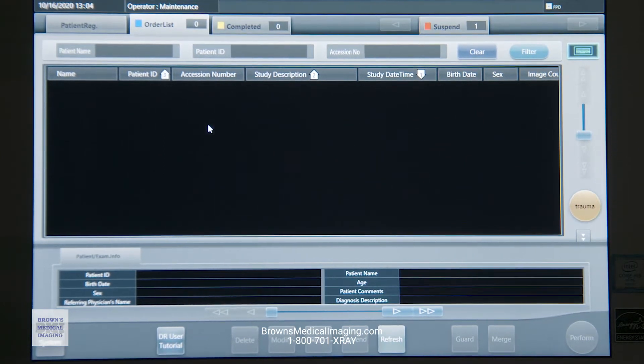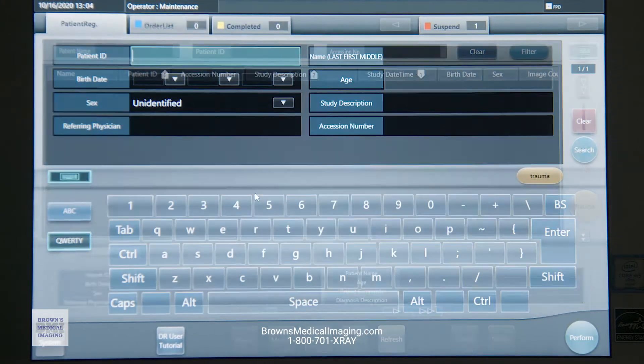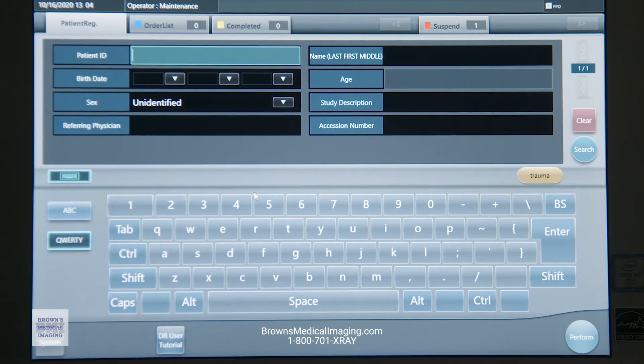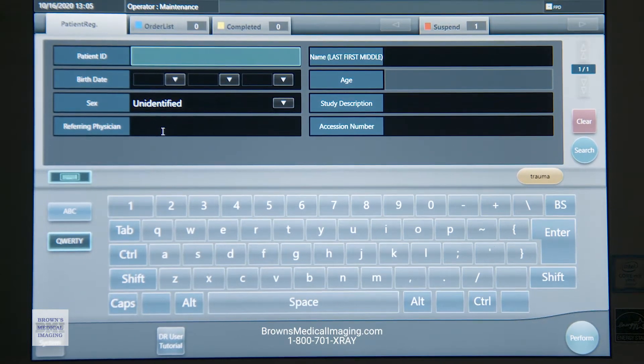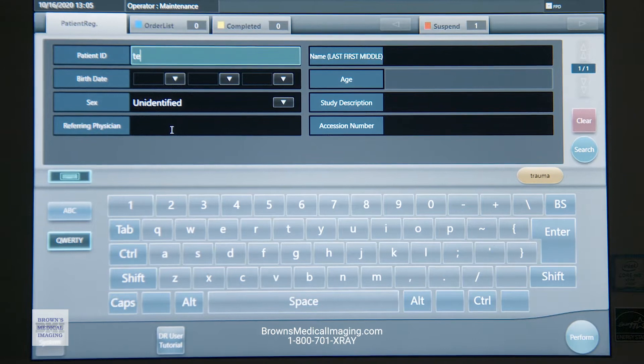If you don't have a work list, we do have the option under patient registration. We can type in that patient information if need be.